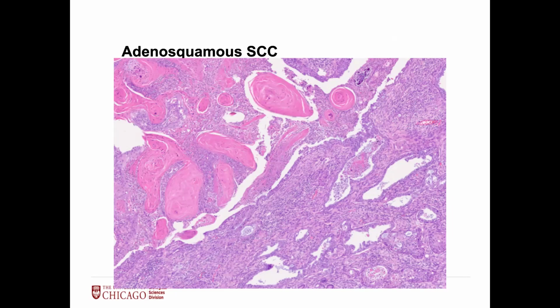On a small biopsy from the larynx, for example, you could notice that you have a squame and that you have some of these areas that look a little ductal. And you could make a comment saying, well, this ductal component could represent overgrowth of just pre-existing glands that are in the area. But the possibility that this could be adenosquamous cannot be entirely excluded. Final diagnosis is deferred to excisional specimen if available in the future. You could raise that possibility even on an incisional biopsy if you're starting to see little glandular component. And maybe sometimes think, should I rule out a mucoep, let's say if you're in the oral cavity.